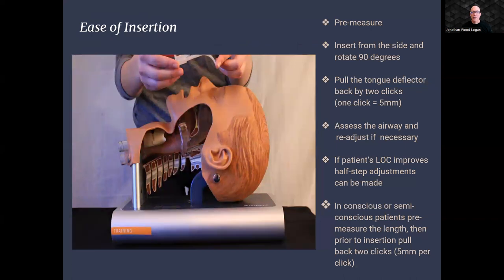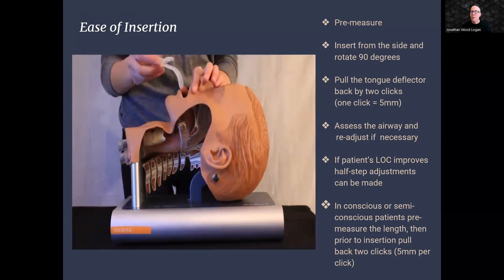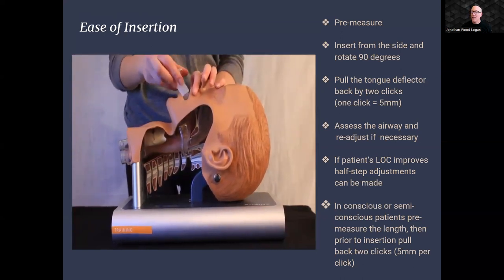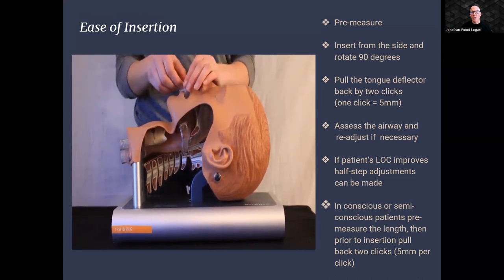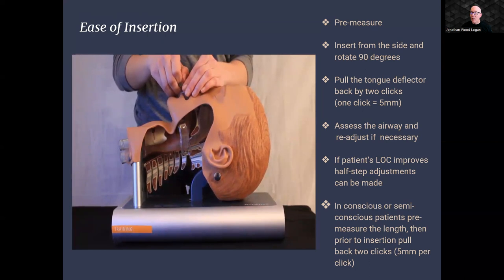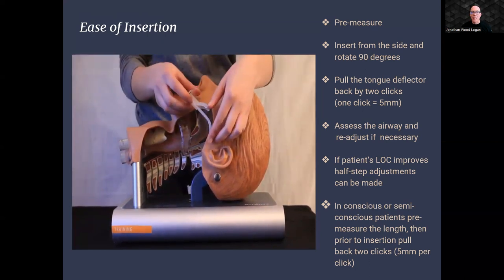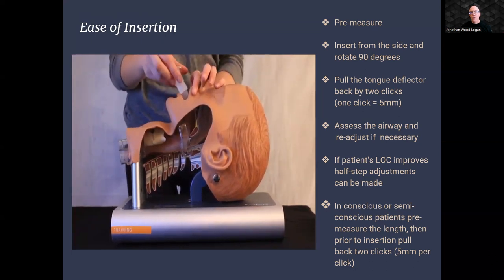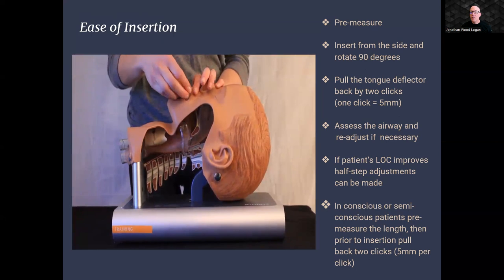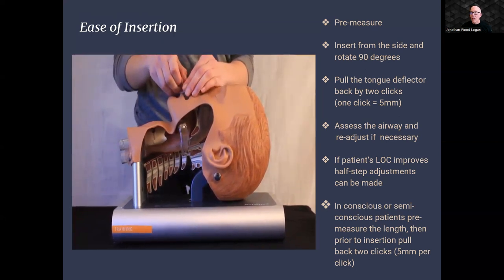Key steps for easy insertion. First, pre-measure: begin by selecting the appropriate size using the measuring bar or standard OPA pre-measure technique, as per your preference. Next, gently insert the Dual Air Adjustable Oral Airway from the side of the patient's mouth, taking care not to force it. Once inserted, rotate the airway 90 degrees to position it correctly. To ensure a secure and comfortable fit, hold the tongue deflector back by two clicks, with each click equaling 5 millimeters.